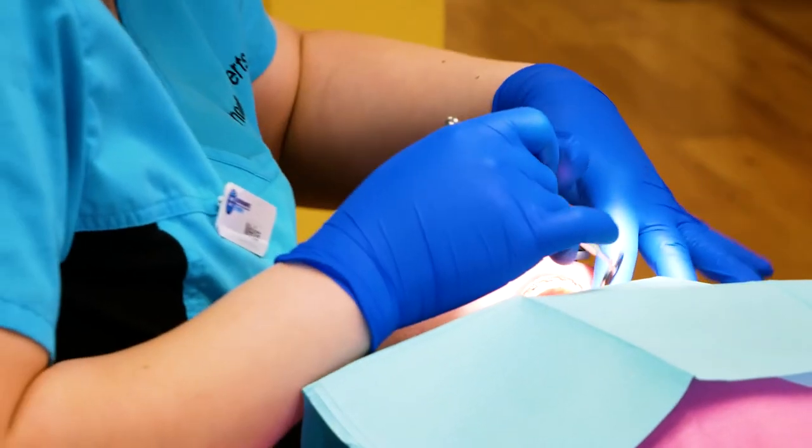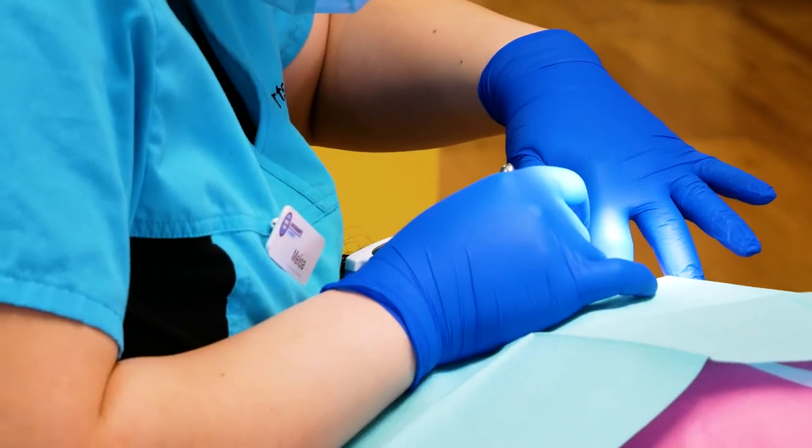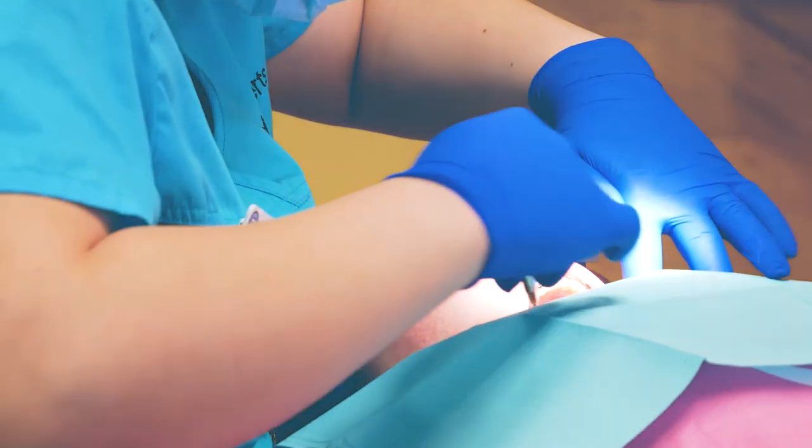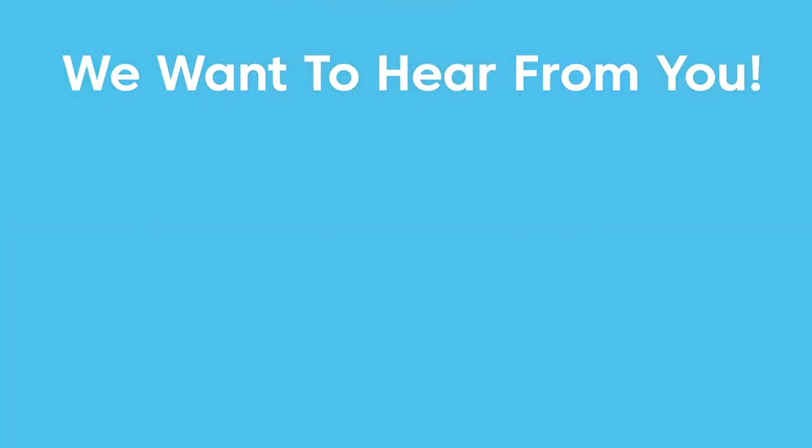An orthodontist can successfully apply bands to your teeth using these tools. If there is an orthodontic tool that you would like to learn more about, let us know in the comment section below.